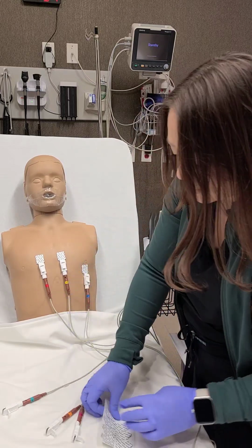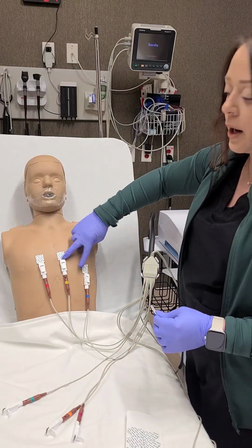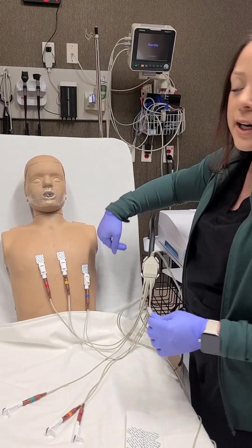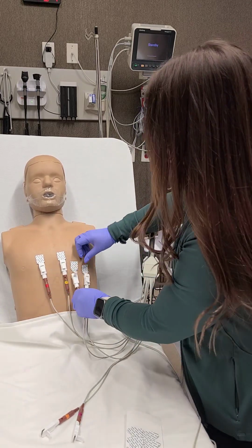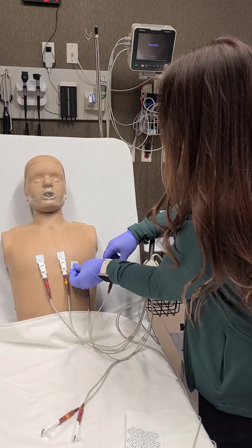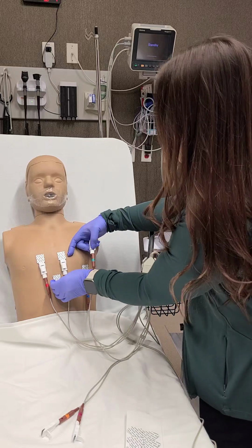Now you can go back to your V3. V3 is going to go between 2 and 4 in a curvature line kind of hugging the heart there. Right there. That's V3. Please don't put V3 over here. It should not cross over V2.